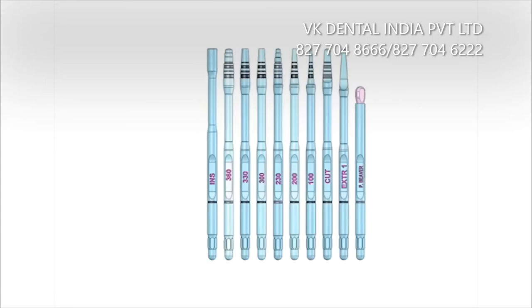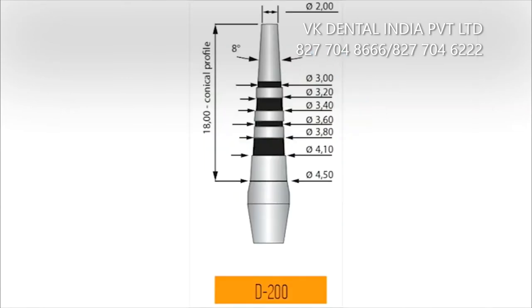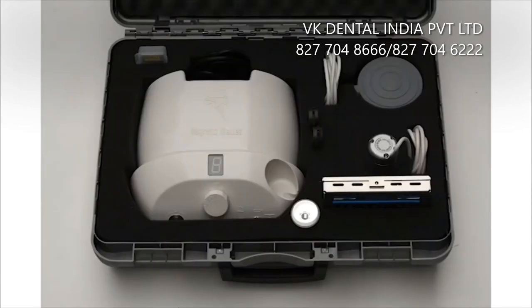All the surgical instruments except for the beaver and the extractor are laser marked to show the difference in depth, making the check easier during surgery. The standard kit also includes one spare silicone cap with one spare ring nut, two wrenches, a container with two blades, and instructions for manual use.